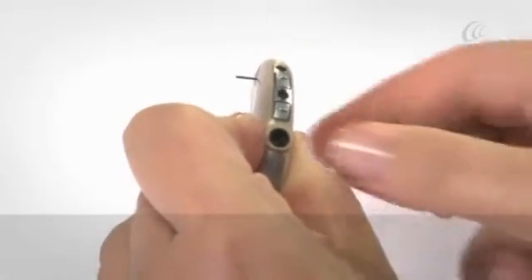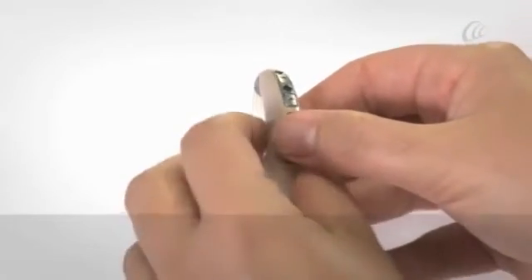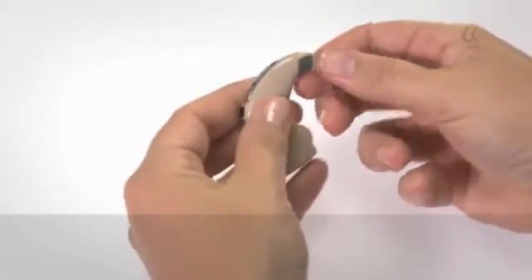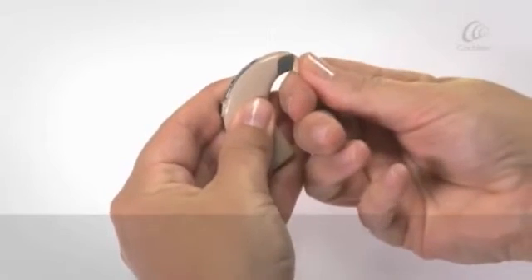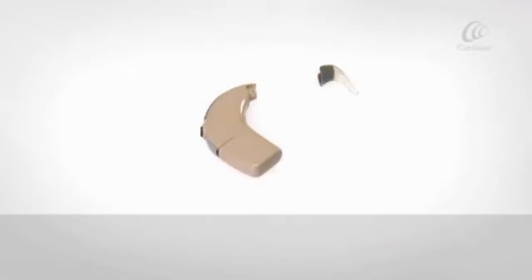Be gentle, as too much force may damage the tool. Lift out the earhook fitting pin. Press firmly on the top of the earhook with your thumb and click it off the sound processor.